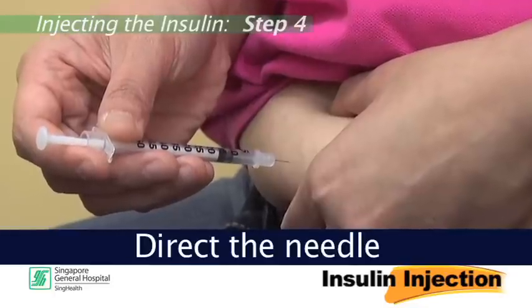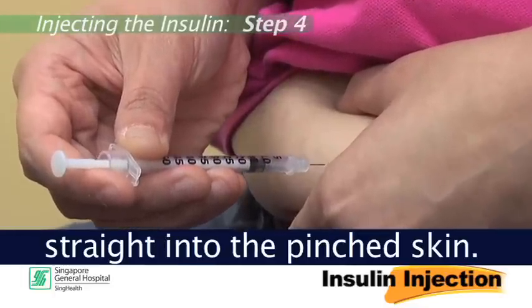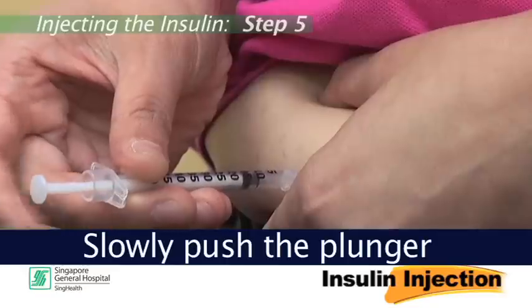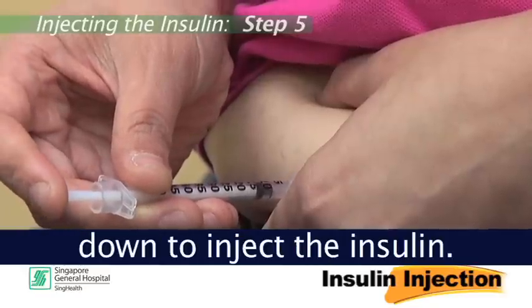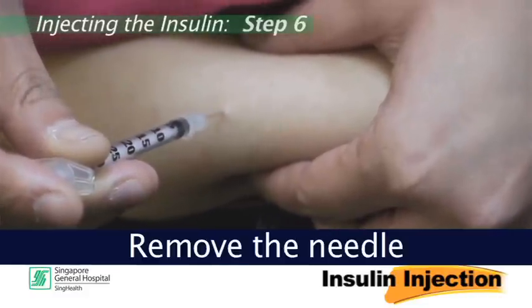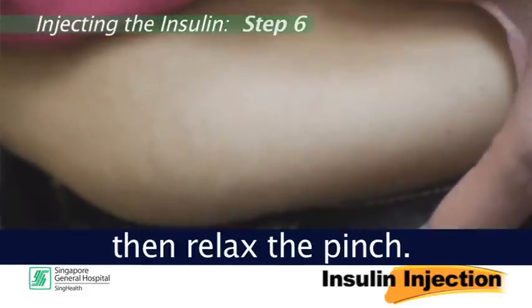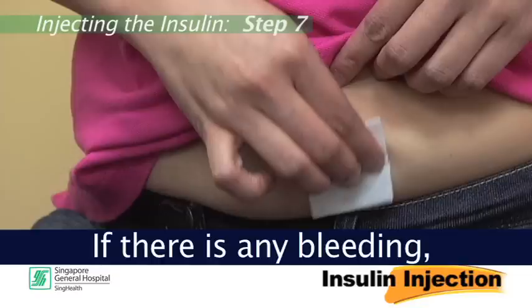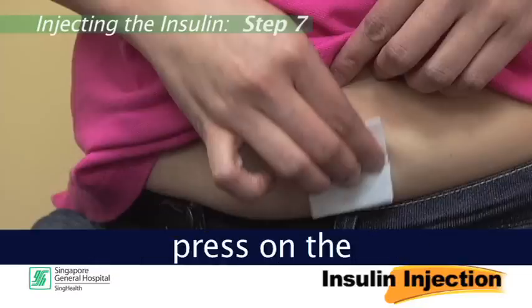Step 4: Direct the needle straight into the pinched skin. Step 5: Slowly push the plunger down to inject the insulin. Step 6: Remove the needle, then relax the pinch. Step 7: If there is any bleeding, press on the injection site. Do not rub.